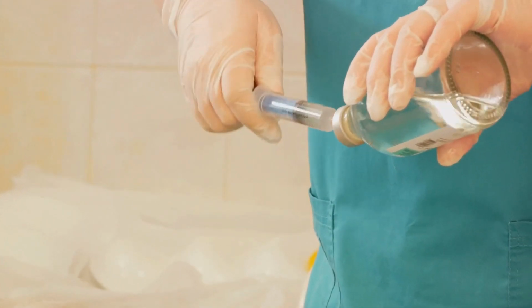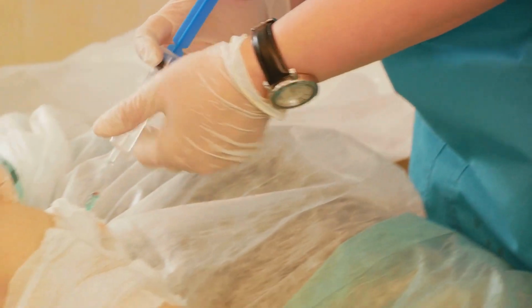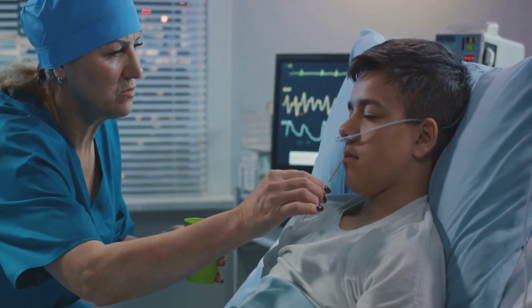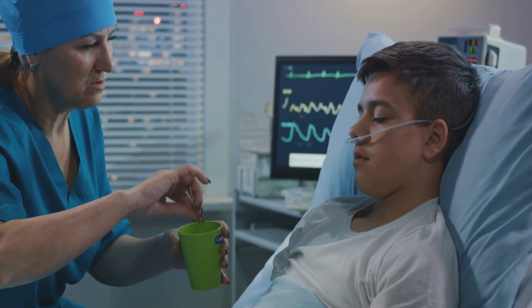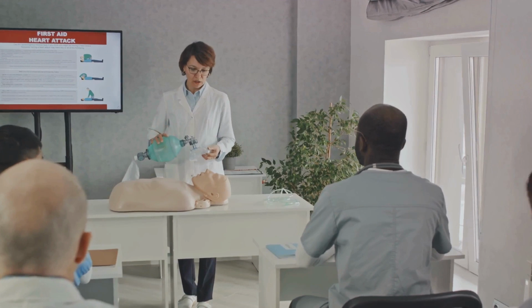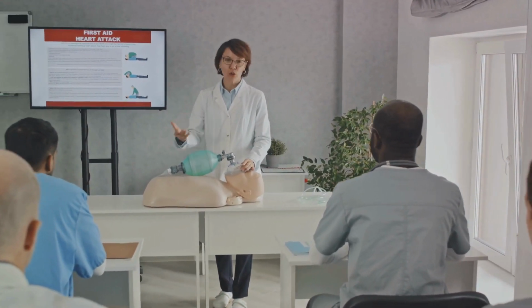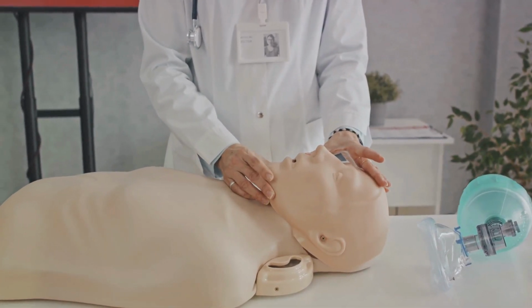Key points to remember include the importance of gentle handling to prevent nasal trauma, the need for adequate lubrication, and the critical role of patient monitoring throughout the procedure. Remember, it's not just about getting the tube in place. It's about ensuring the patient's safety and comfort at every step of the process. It's also worth noting that while this discussion provides a solid foundation, mastering these techniques requires practice and experience. It's through hands-on repetition, under the guidance of experienced clinicians, that you'll truly become proficient in nasotracheal intubation.